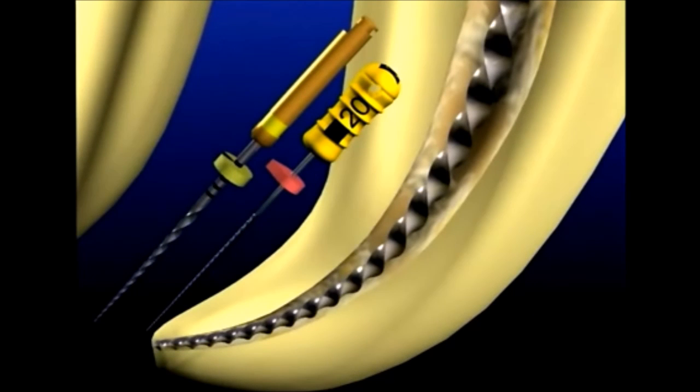Following the use of Finisher 1, the foramen needs to be gauged to ascertain if it's truly a 20 or larger. A 20 hand file is carried to length. If the 20 hand file is snug at length, the case is ready to pack. In the event the 20 file is loose at length, proceed to Finisher number 2.